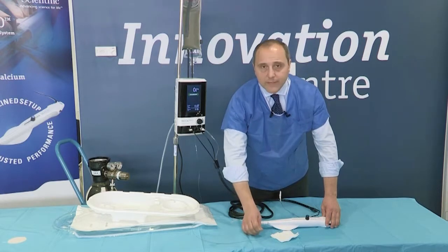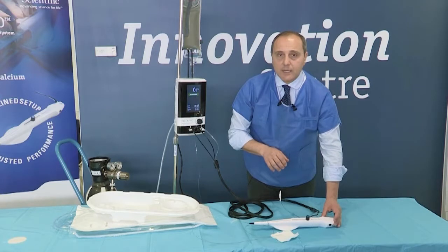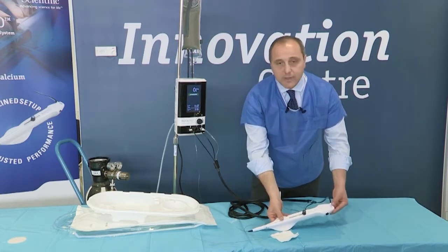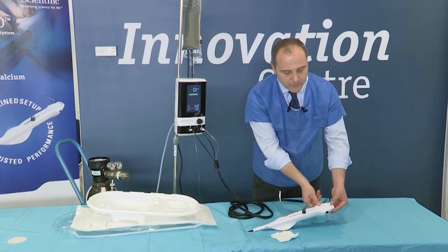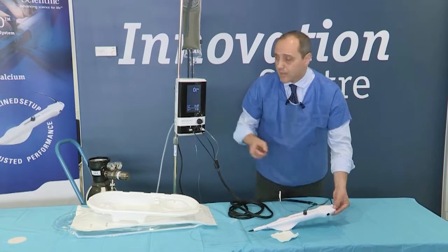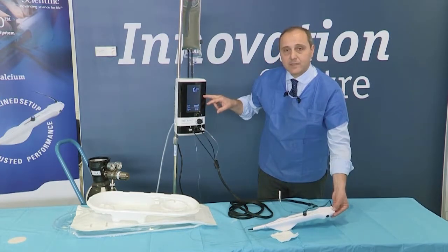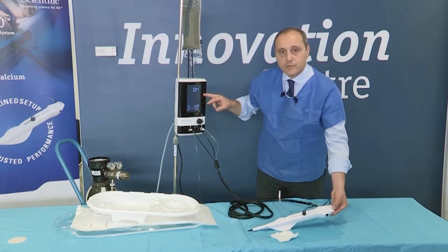I think now we are ready to do a rotablator session within a model that we will show you in a minute. Let's switch back from the Dynaglide mode to the rotablator mode. Let's push again on this button here, and you will see that the Dynaglide signal has disappeared from the console. So once again, you're always informed on what you're doing in order to do a more controlled procedure.